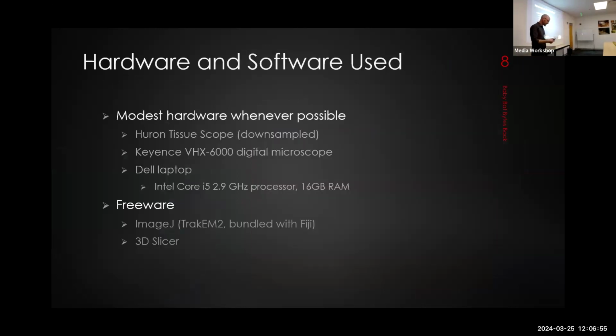Many collections hold serial sections preserved on slides, but not every collection has access to thousands of dollars worth of software and computing power. Therefore, I felt it was important to make this process work on my laptop using free software. So I used ImageJ and 3D Slicer as my primary software packages.